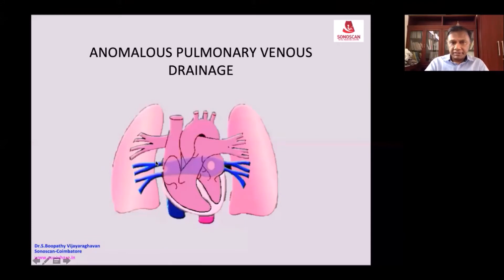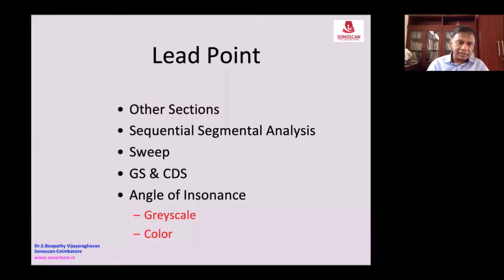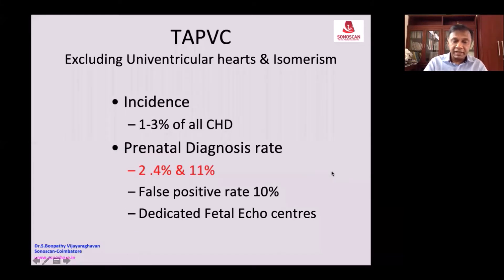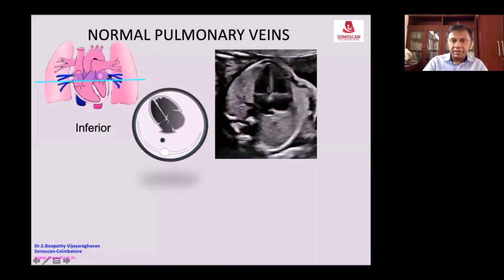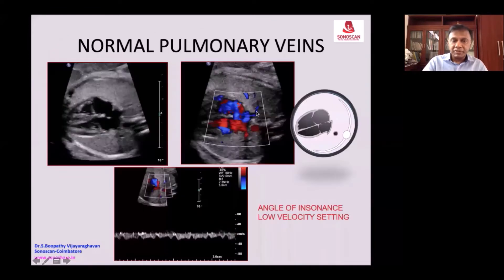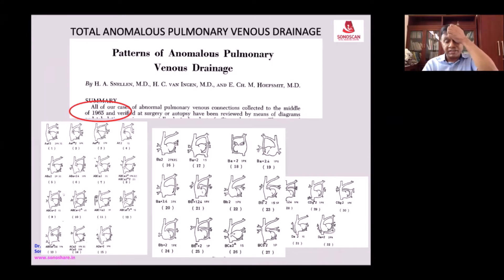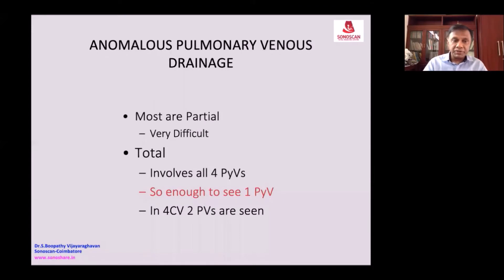Anomalous pulmonary venous drainage — the median gestational age of diagnosis is 27 weeks. This is because there is increased use of the four-chamber view. You see the apical four-chamber view and you see the two inferior pulmonary veins joining the left atrium. With spectral Doppler, you can see how many variations — about 32 variations are possible. But most are partial anomalies — partial pulmonary venous drainage anomalies — so they are very difficult to detect prenatally.